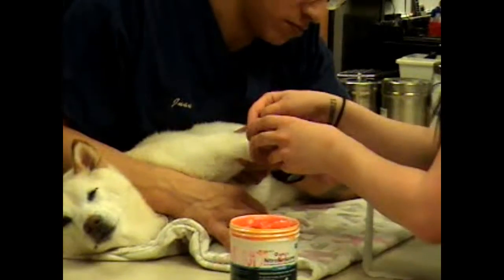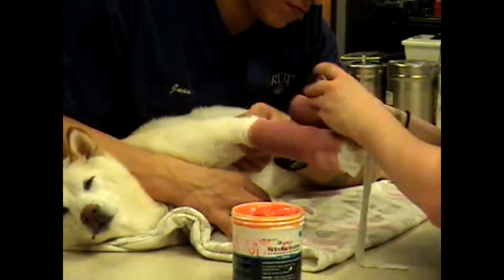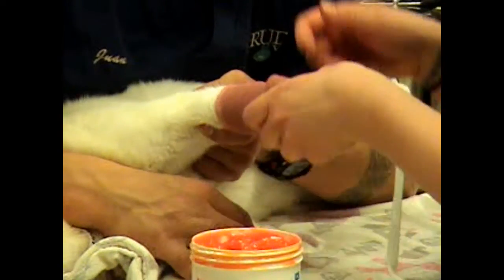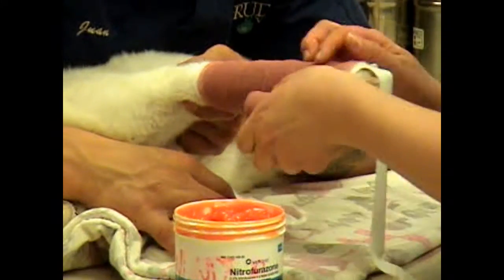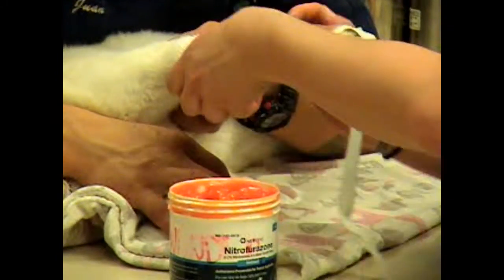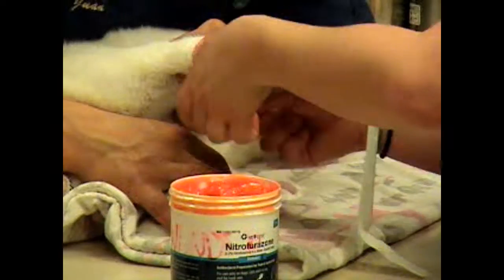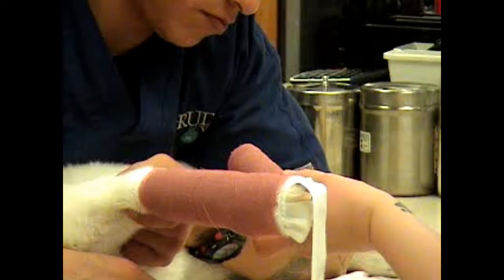I'm just leaving a little bit of that cotton so you can see it up top here. And again, just each layer is going about half of the previous layer there at the bottom — just very gently rolling this around, not making it too tight.